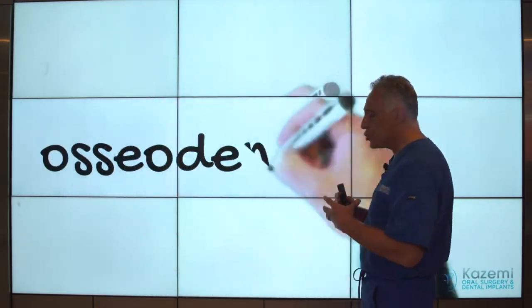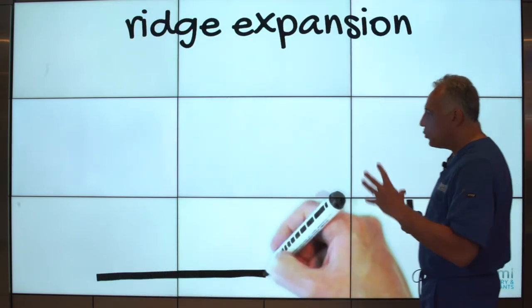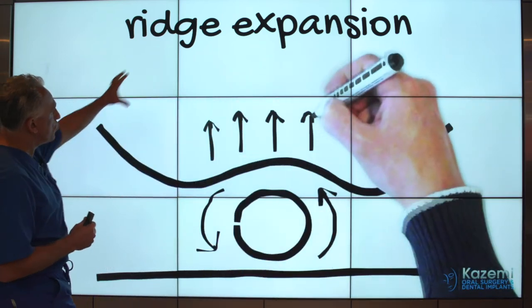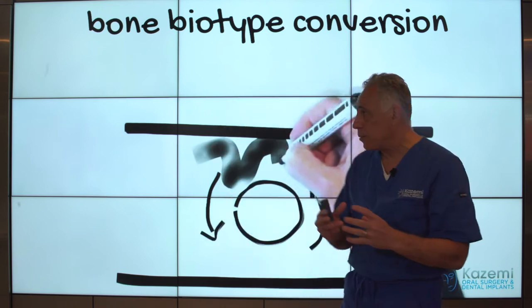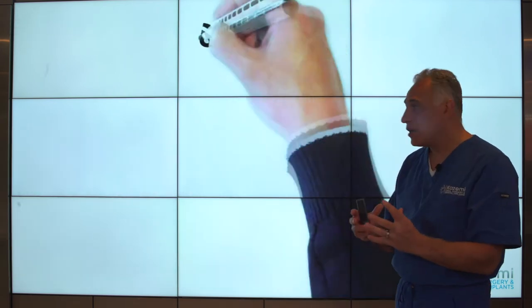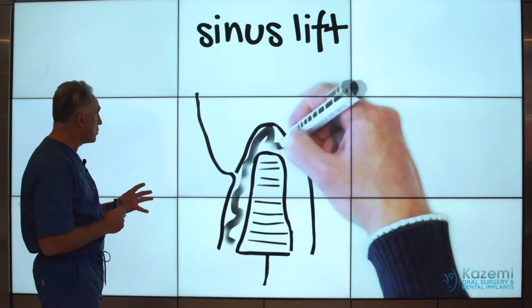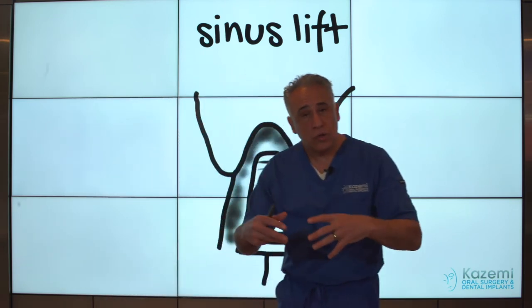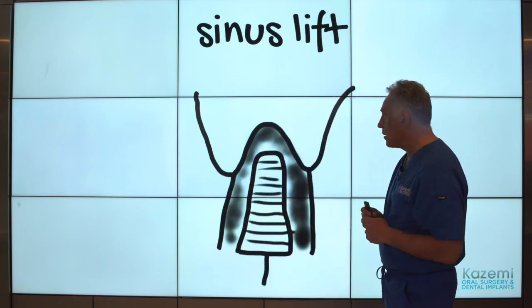This is what brings us to this remarkable technique known as osseodensification. There are three aspects of osseodensification, three benefits from this technique. The first is ridge expansion. The second is biotype conversion of the bone, essentially taking it from a thin biotype, D3, D4, and converting it into a D1 or D2. And the third is the sinus lift, which we'll address and I'll show you in a few moments, essentially being able to use this osseodensification technique to raise a sinus floor in a most conservative and minimally invasive technique.